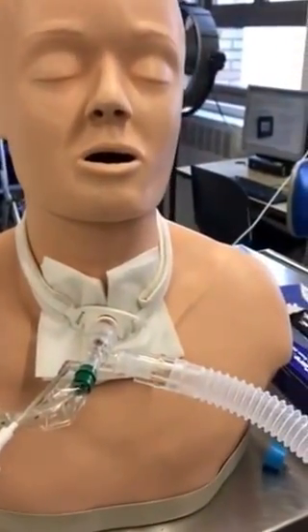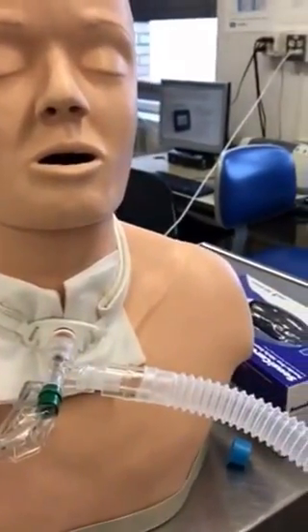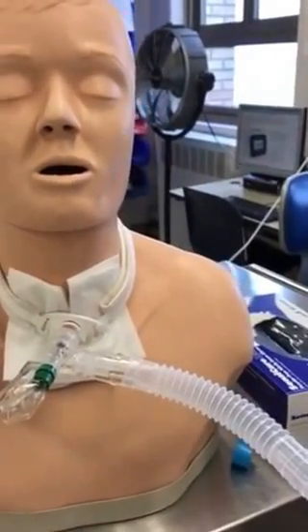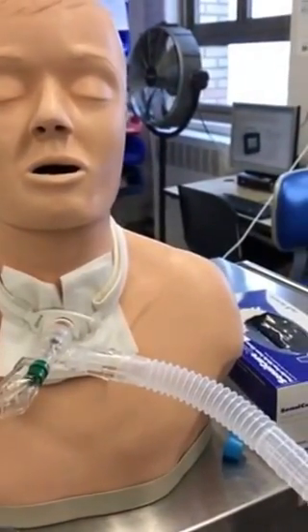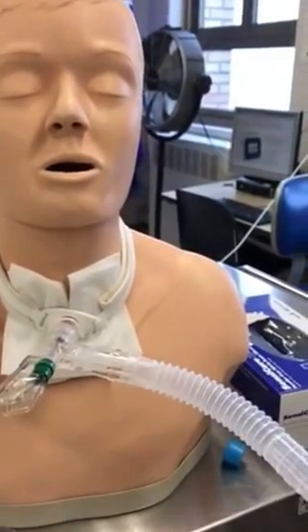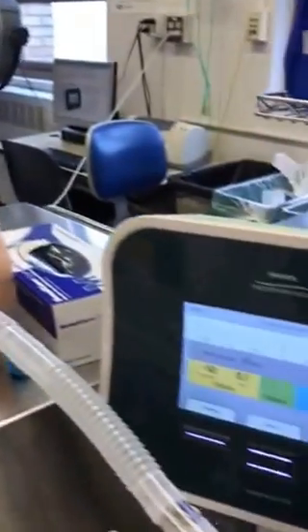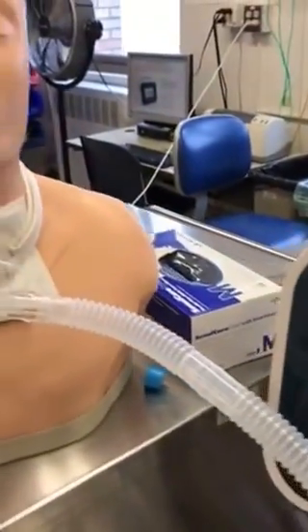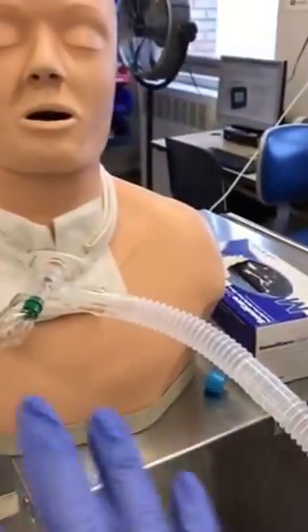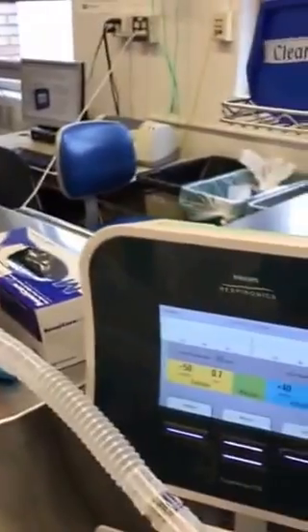Explain to them why you're doing this, before every treatment, because sometimes patients can get a bad anxiety, especially with a new injury in their spinal cord. It could be very hard for them. We're gonna start by counting and giving them that breath. Usually you wouldn't have this much time waiting, so give them a couple breaths, and then start it up.